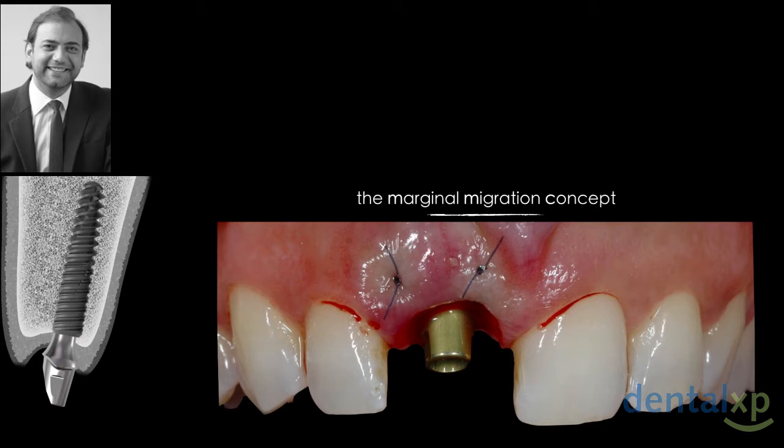We expect some shrinkage to the distal papilla when we're dealing with a central incisor site, because we leave a smaller attachment surface to this papilla, meaning we only have the lateral holding this papilla and not the central anymore.